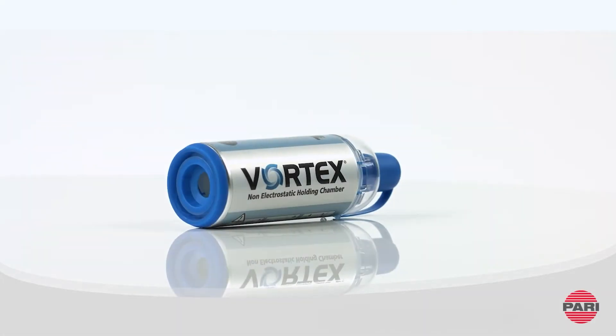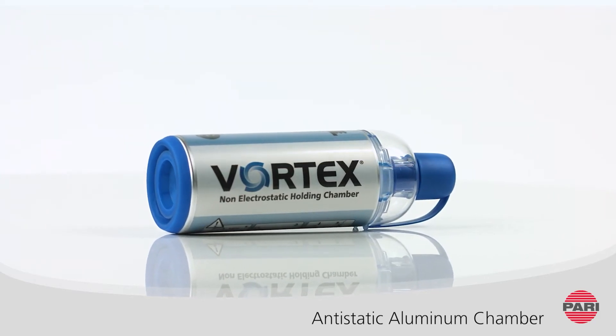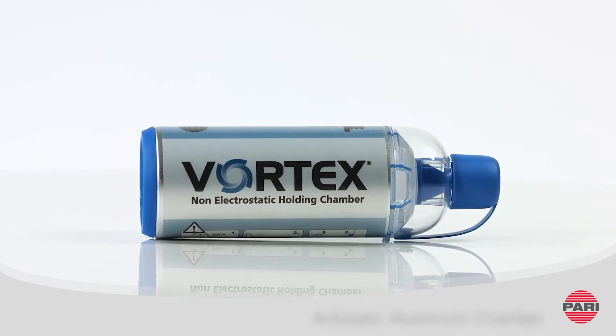The Vortex is an anti-static aluminum chamber not made with BPA or latex. The anti-static effect helps ensure a consistent dosage and increases the amount of medication that actually reaches the lungs.